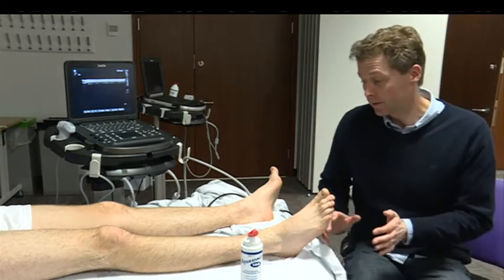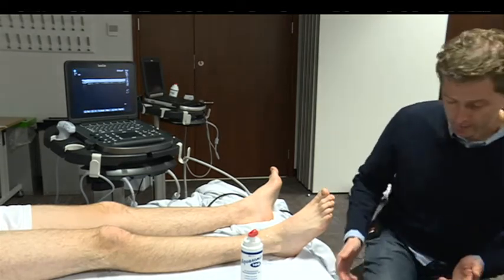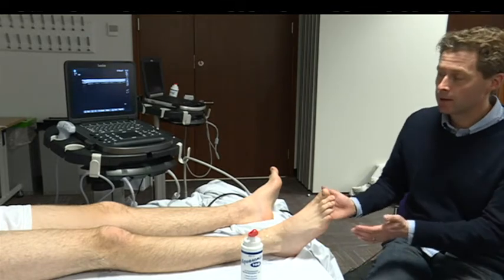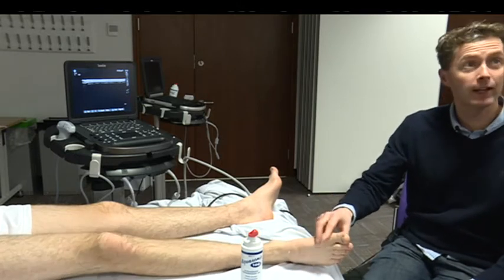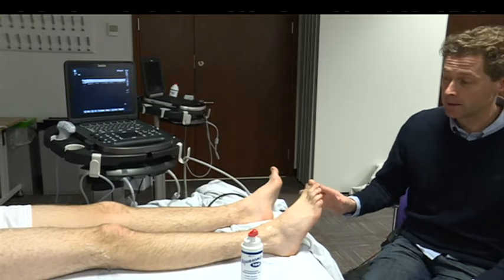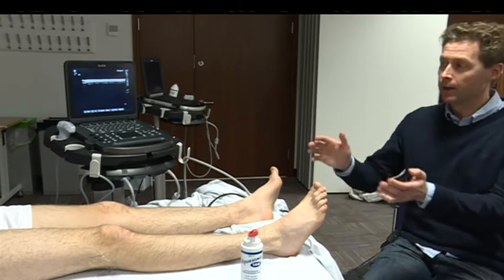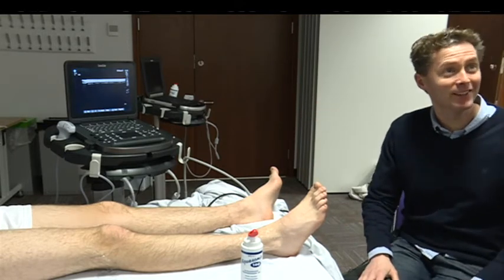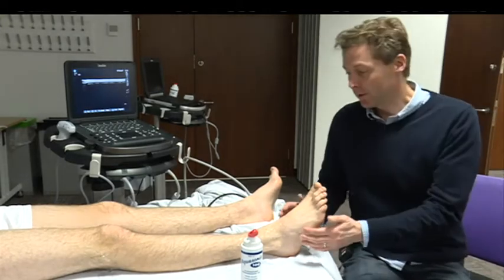Once that's done, you can pretty much sit at the end of the bed. I tend to sit with my legs underneath the bed. If the patient can internally and externally rotate the hip, you can just move the leg around. If they're less mobile, you can get them to lie on one side. I'm lazy and I like to sit in one place and do my block.